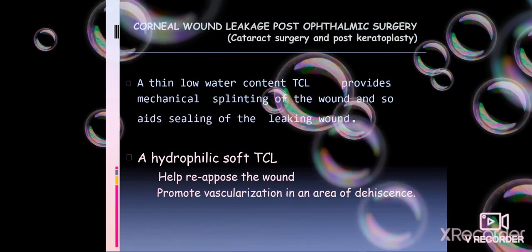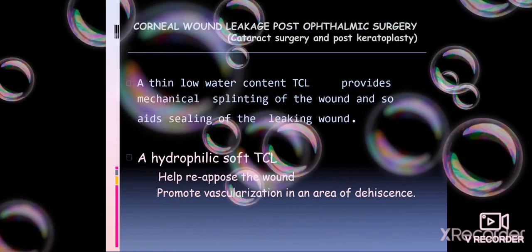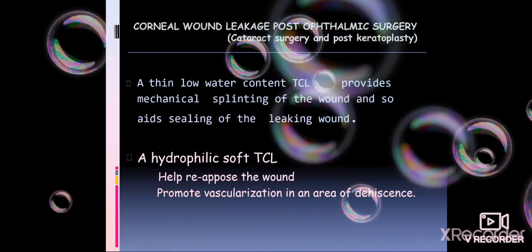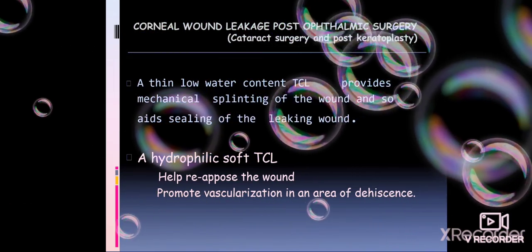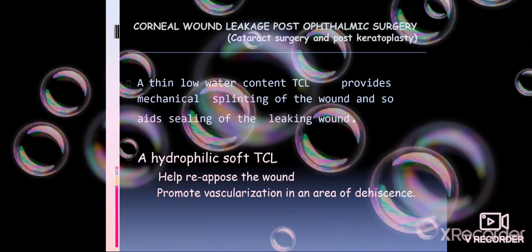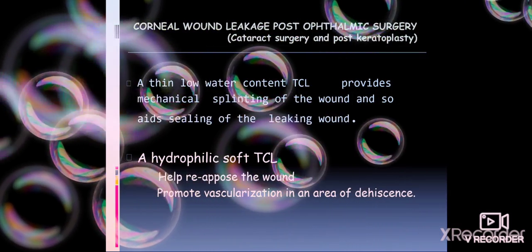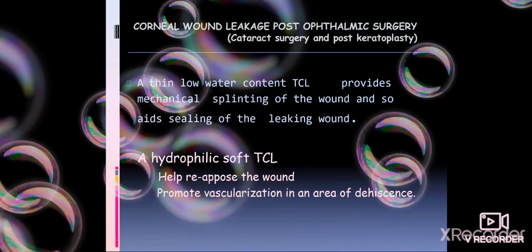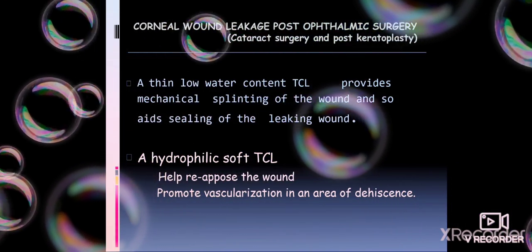Corneal wound leakage after ophthalmic surgery: whenever there is cataract surgery or post keratoplasty, that is corneal transplant surgery, with the help of a knife we give an incision, due to which the aqueous comes out. Sometimes this wound or incision doesn't heal, so in that case we use the therapeutic contact lens, that is a hydrophilic soft therapeutic contact lens.